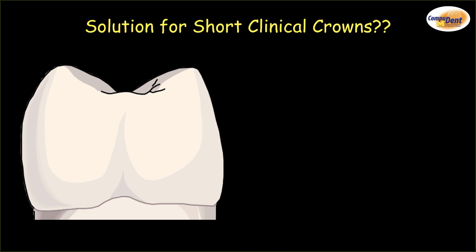So how do we put this together now? We talked about the restorative material. We talked about the importance of the prep. We talked about the bonding sequence and how they can interact with each other. So now I'm faced with this situation. I have a short clinical crown. Let's say I want to cement it. I've made my decision. I would rather cement things.